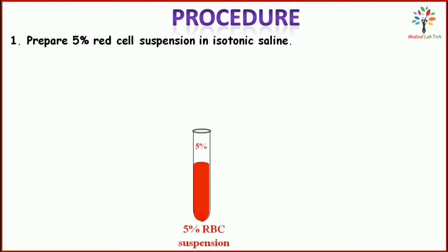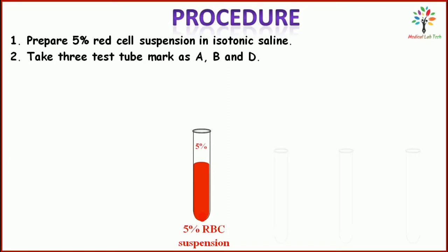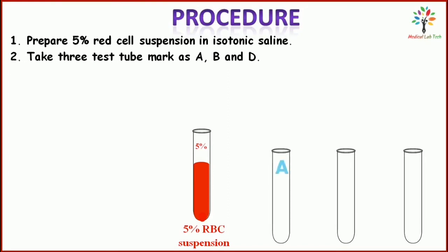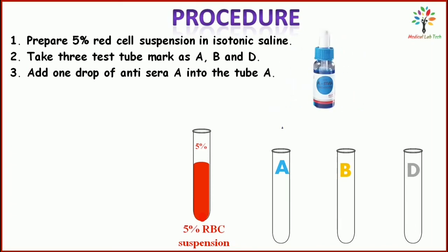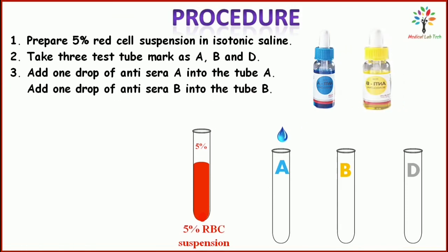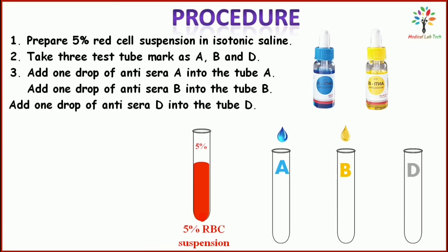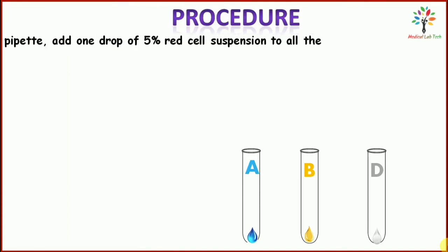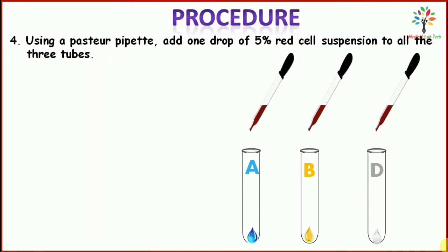In step 2, take 3 test tubes and mark them as A, B, and D. Then add 1 drop of antisera A into tube A, 1 drop of antisera B into tube B, and 1 drop of antisera D into tube D. Using a Pasteur pipette, add 1 drop of 5% red cell suspension into each tube.